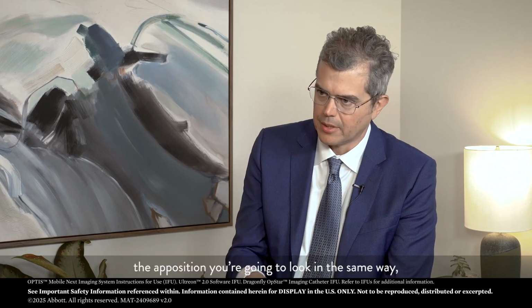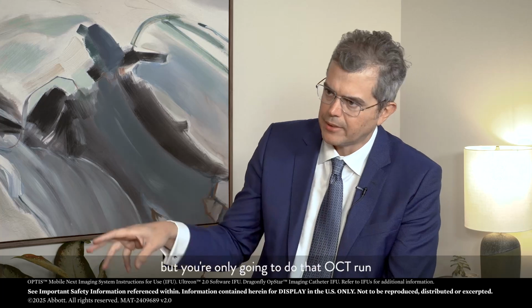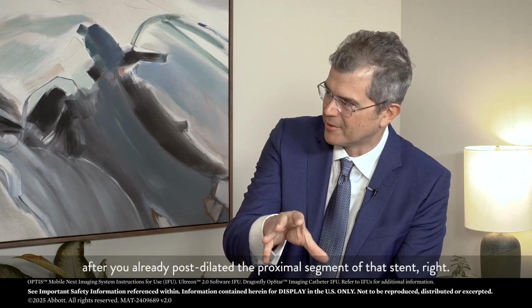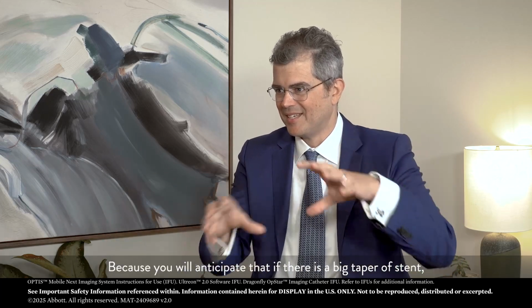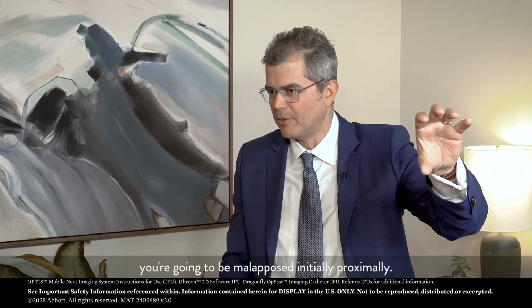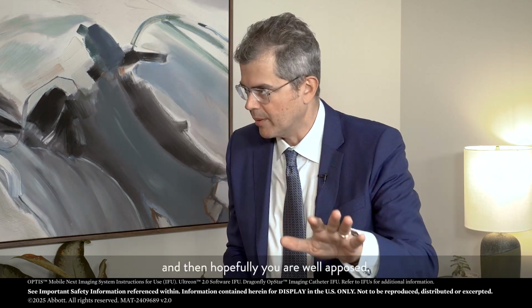The apposition, you're going to look the same way, but you're only going to do that OCT run after you already post-dilate the proximal segment of that stent. Because you will anticipate that if there is a big taper of a stent, you're going to be malapposed initially proximally. You correct that prior to the OCT run, and then hopefully you are well apposed.